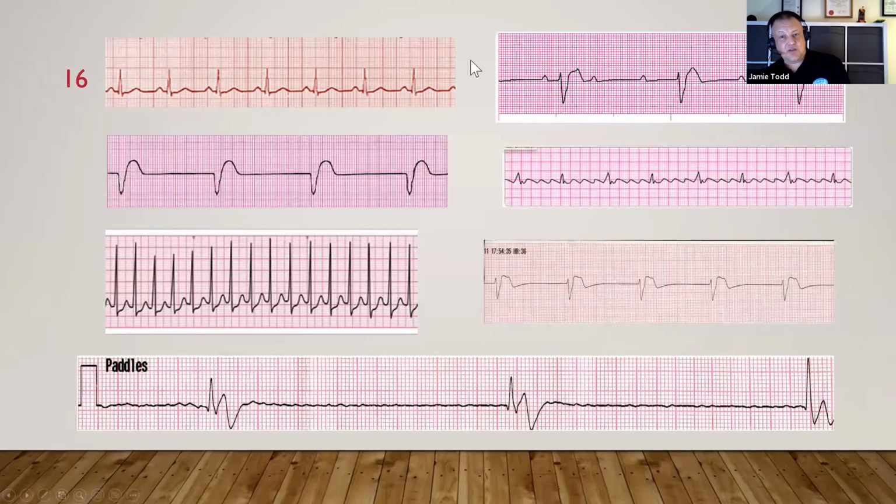And I think the question would be, given 5 seconds, which of these rhythms with no pulse is a PEA? Before you start looking too closely, remember, don't get confused. All these rhythms are a PEA if they've got no pulse, because there is organized electrical activity of some sort. So these are all a PEA. The trouble is, when you put a PEA in a book, that's what people see. And then when they don't see the one that's in the book, they're not sure what it is, and that's clearly a problem, I think.